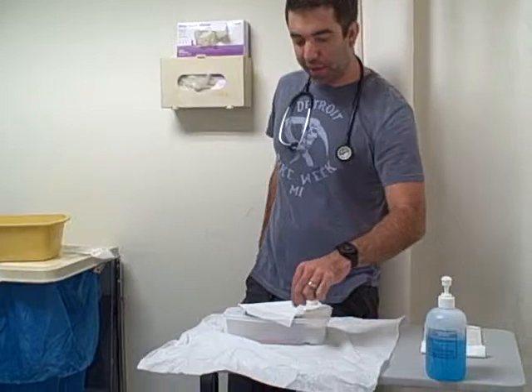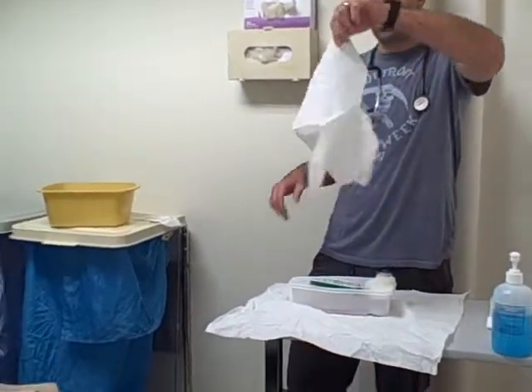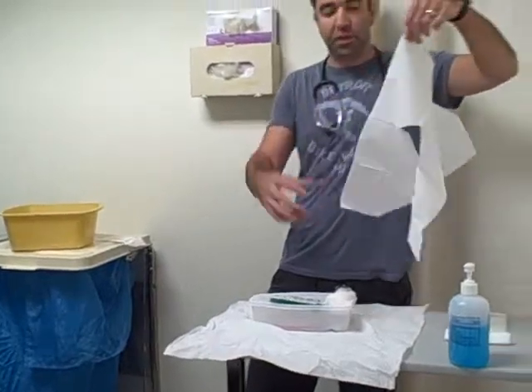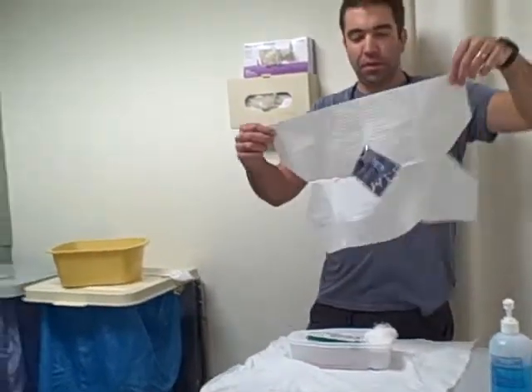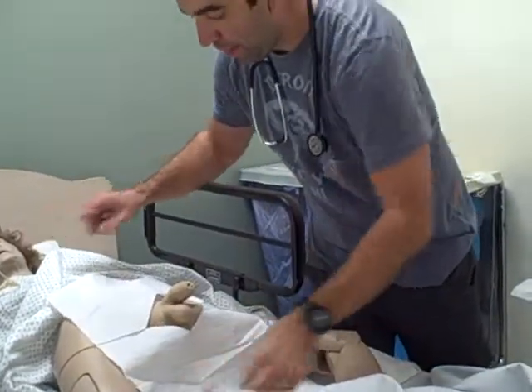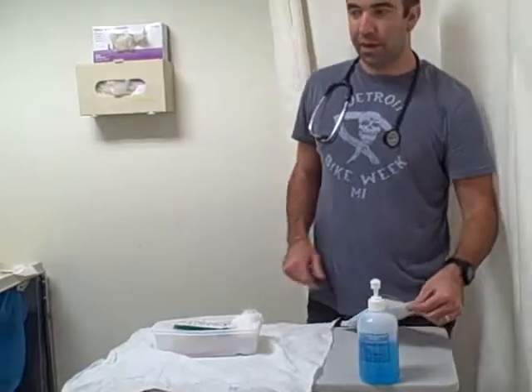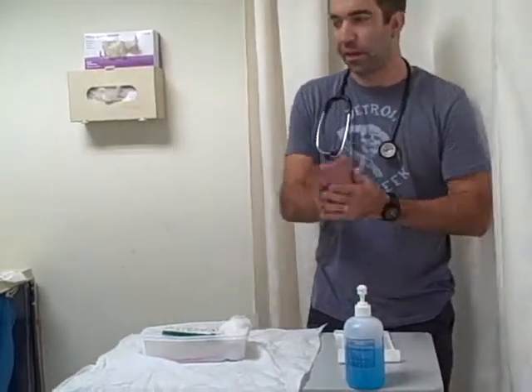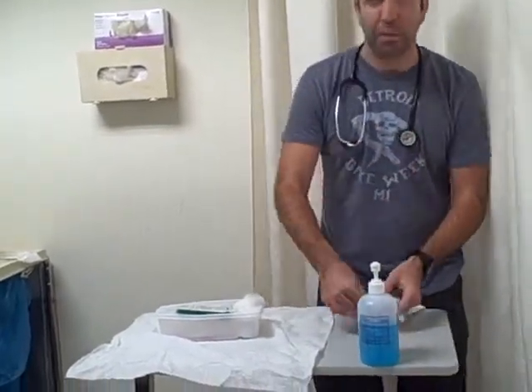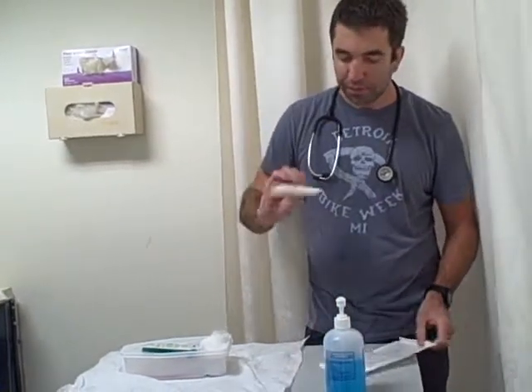Next piece of equipment I have is another piece of cloth. I'm gonna put this over the penis. Alright, so then moving on, I'm gonna wash my hands in case I haven't done that. Open up my sterile gloves. Garbage.